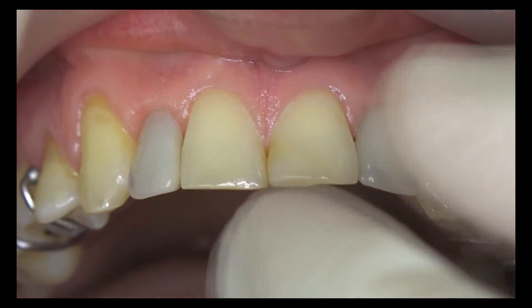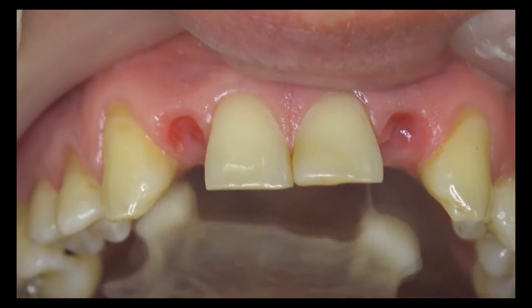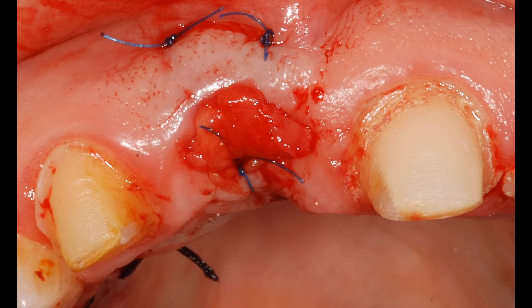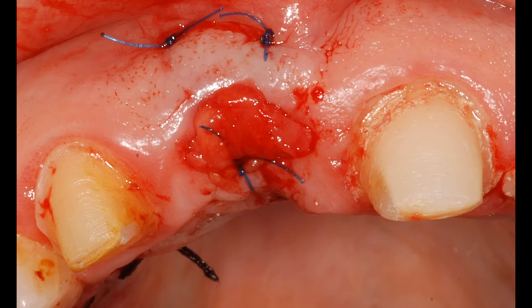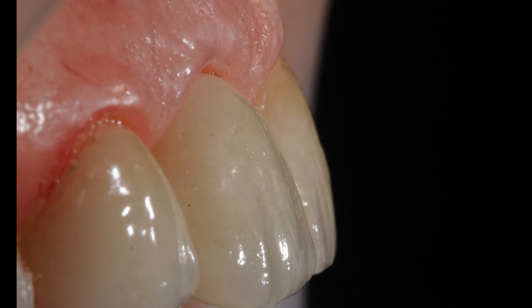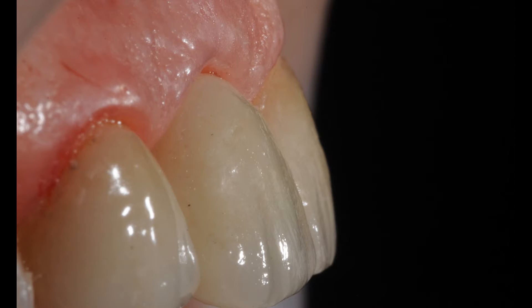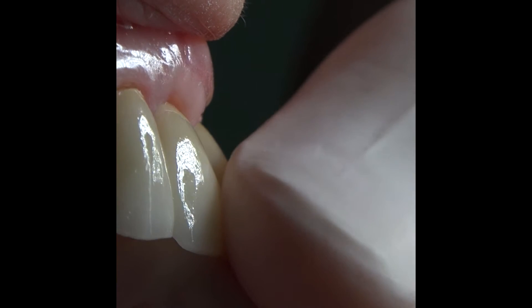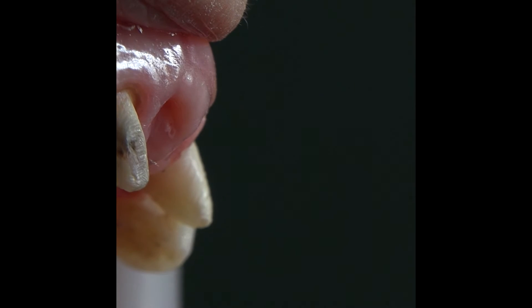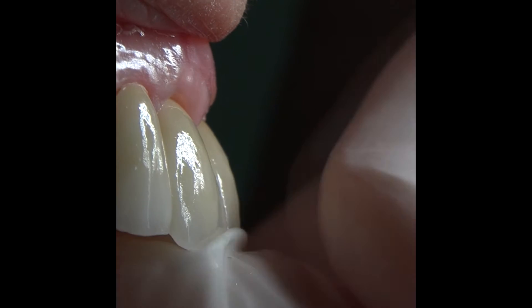This procedure can be completed with different techniques using removable or fixed restorations, surgical methods, or straightforward approaches. Several applications will be shared in upcoming videos. Whatever technique is used, the result is highly aesthetic due to long-term hard and soft tissue stability, as well as the appearance of a natural tooth stemming from the soft tissue.